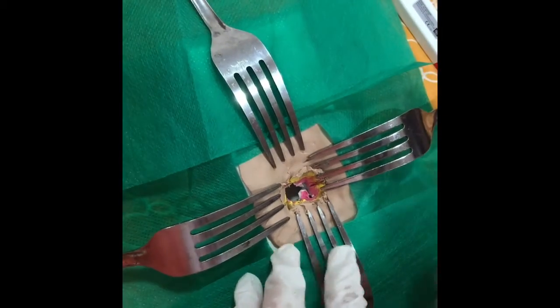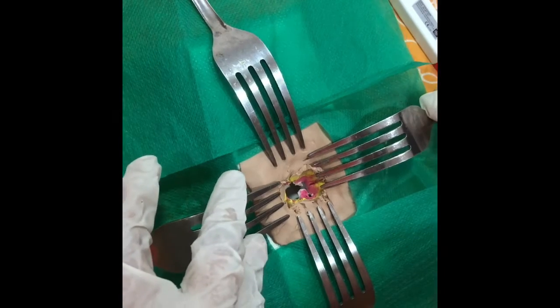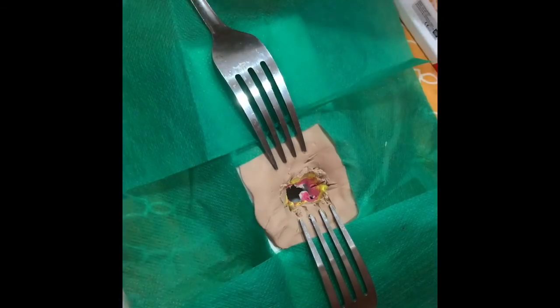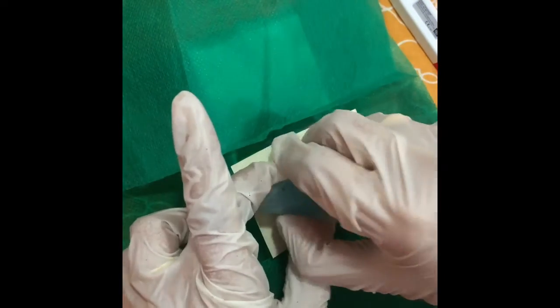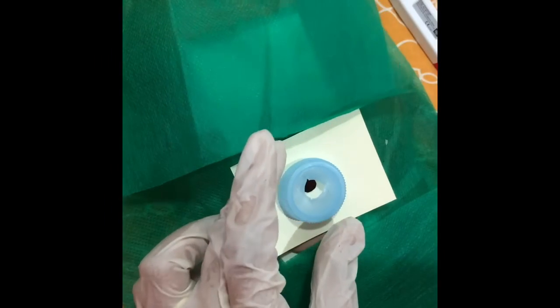The airway can be entered in any number of ways to include vertical, horizontal, or H-shaped incisions. The author prefers a horizontal incision between rings 2 and 3 with the creation of a Bjork flap. Once in the airway, the ETT is pulled back so that the tip of the tube is just above the opening. If necessary, this allows the tube to be quickly advanced to re-establish ventilation.